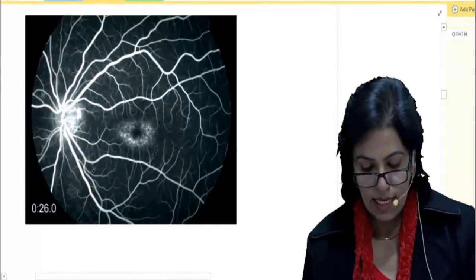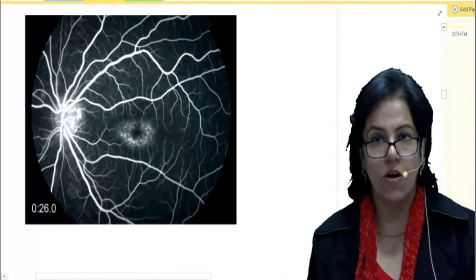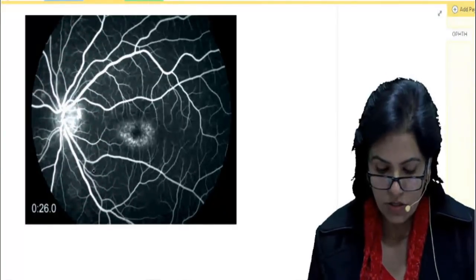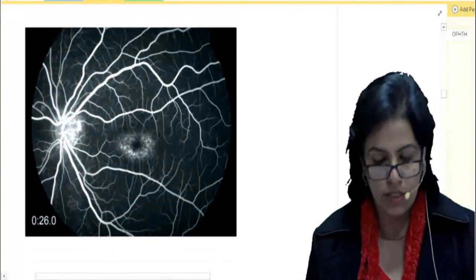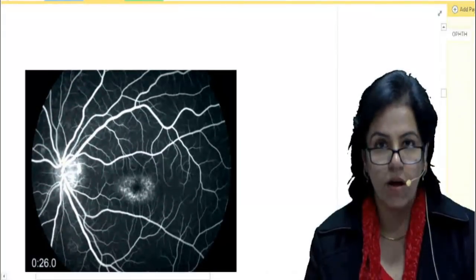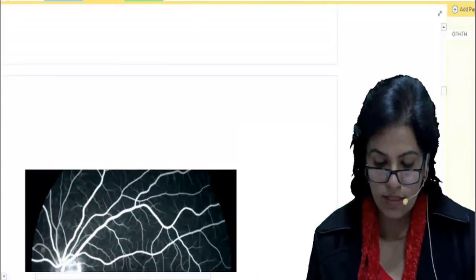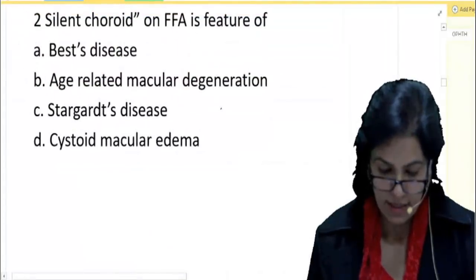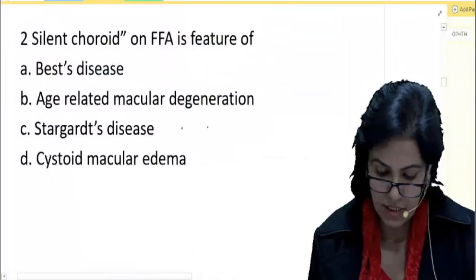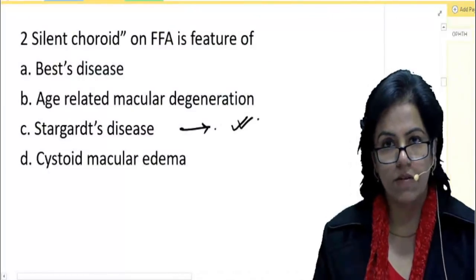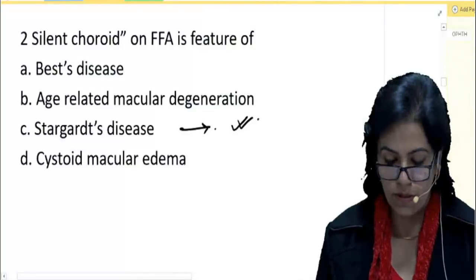Why it is happening? This is happening due to deposition of lipofuscin pigments. Due to the deposition of the lipofuscin, it blocks the fluorescence of the choroid and this is a feature of Stargardt's disease. Deposition of lipofuscin is blocking the fluorescence.